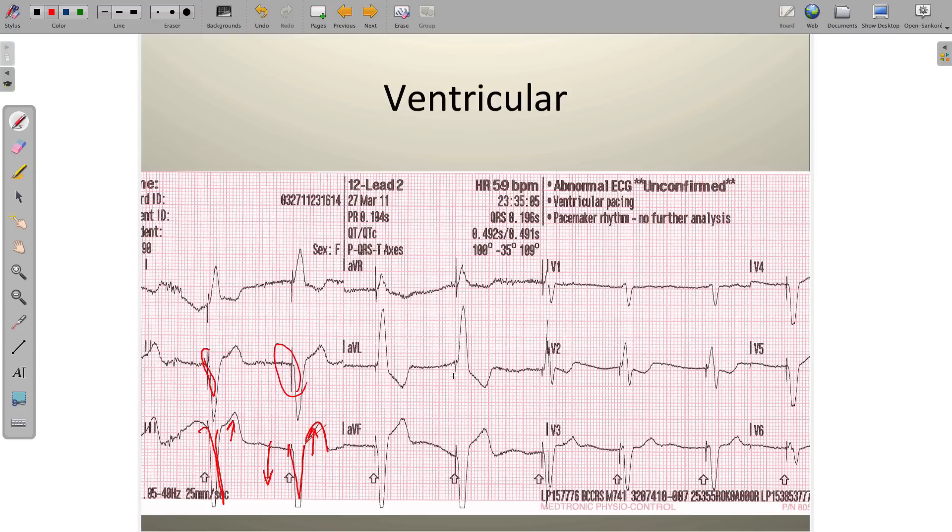It's going to appear the same in each and every single lead: the spike, the wide QRS, followed by a T wave that opposes the QRS force. So if the QRS is upright, the T wave is inverted; if the QRS is negative, the T wave is upright. It's this discordance that takes place. Any time you see a pacemaker spike — rapid, single moment in time event — followed by a wide QRS and discordance between the QRS and the T wave, this is known as a ventricular pacemaker.